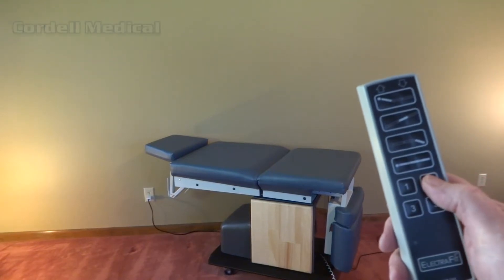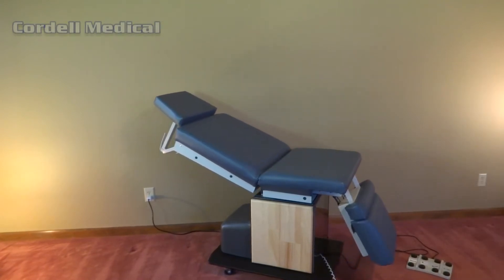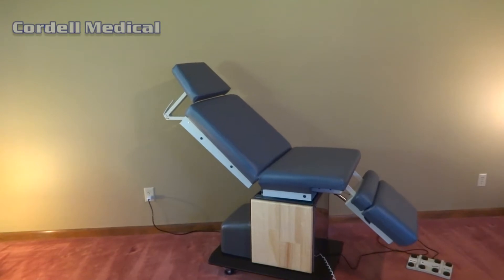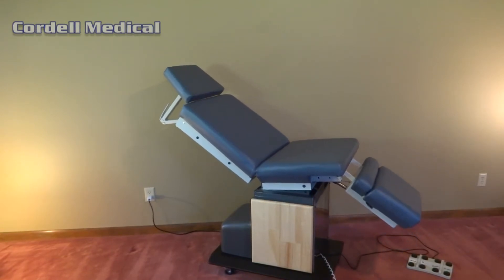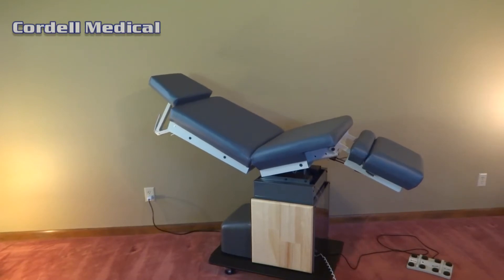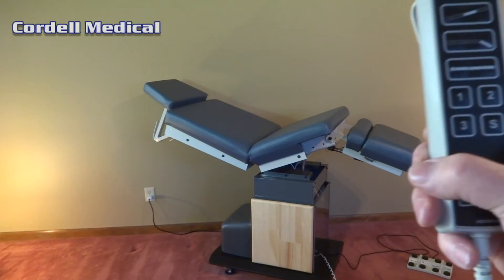Cordell Medical brings Midmark 75 model 111 and 119 tables into the 21st century with a powerful programmable actuator system designed by ElectraFit. All the old electrical and hydraulic system is completely removed. No more oil.